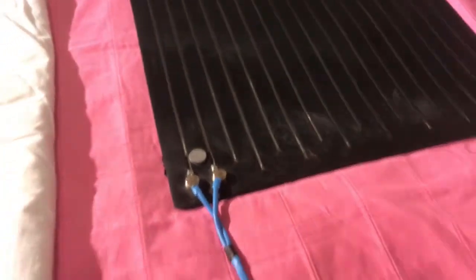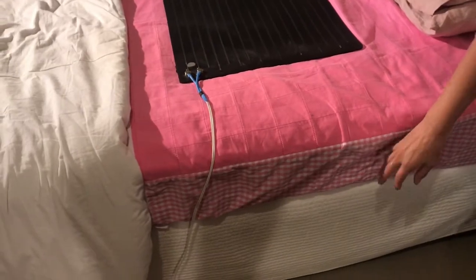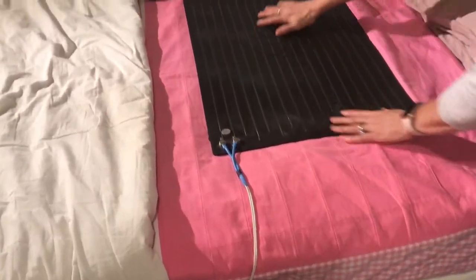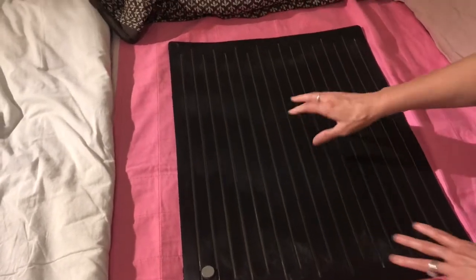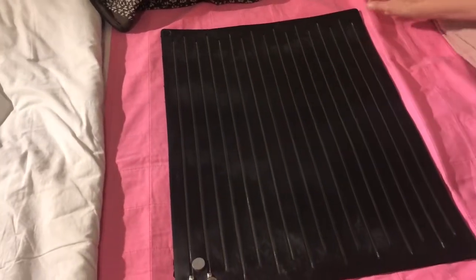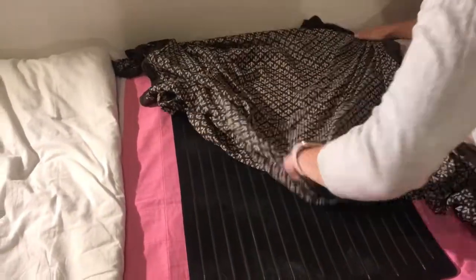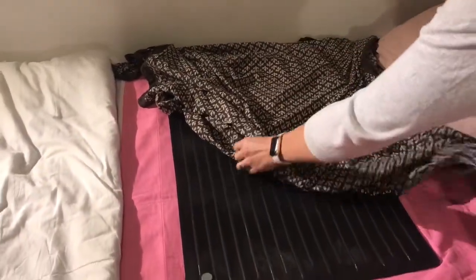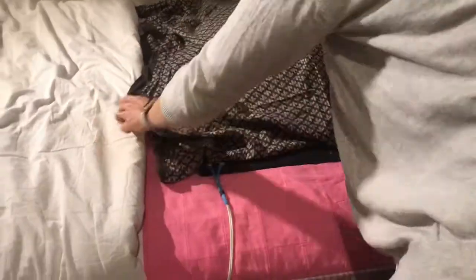How we set up the bed is: you have your sheet and a mattress protector tucked in, and then you have the bed pad long ways across the bed like this, and centre it so that the child's bottom will be about in the middle of it. Then I cover it with something really light — I actually use a sarong because they're nice and easy to replace in the middle of the night.